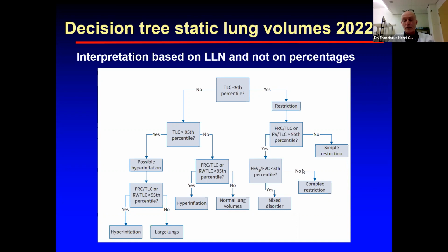So if you then want to be sure, go for the static lung volumes. Yeah, I would echo the same. This is a question that comes up quite a bit. So I'd love to hear what you do, what you guys do in your lab and in the Netherlands.